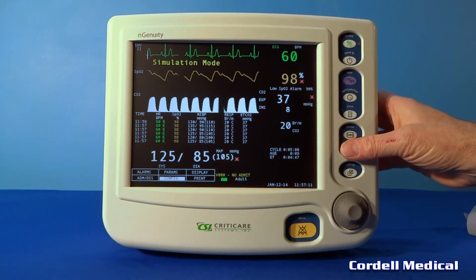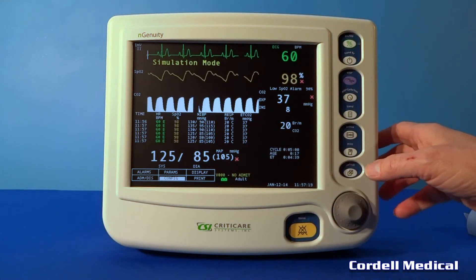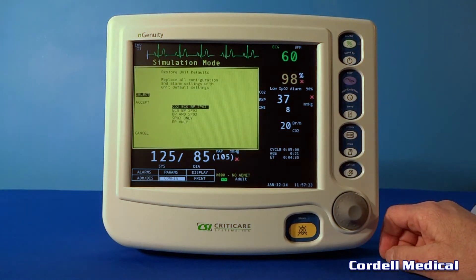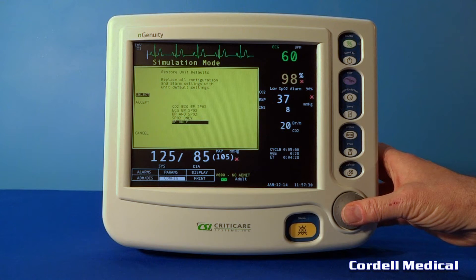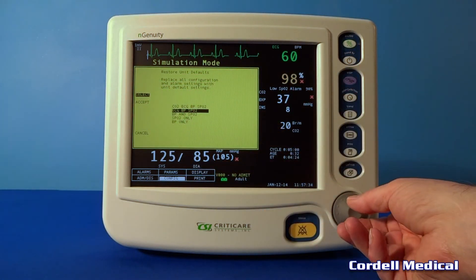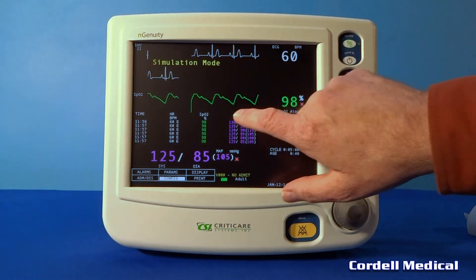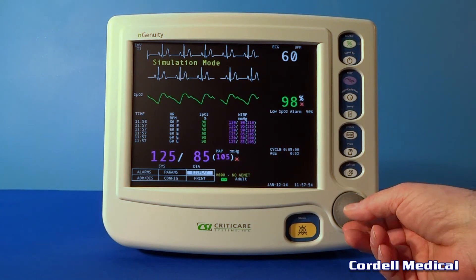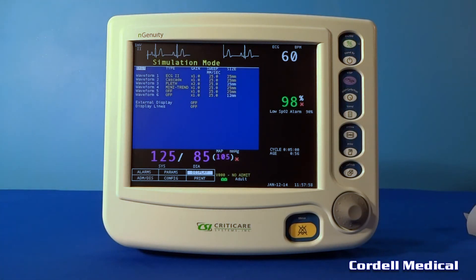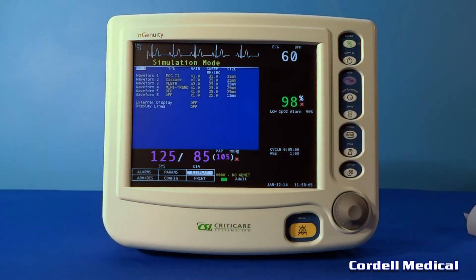When you go to print, pressing the print button once gives you one set of vital signs, and pressing and holding will give you the mini trend. Here you can press and hold and change between functions. Right now we're going to go to ECG, SpO2, NIBP — so at this point we are out of CO2 mode. It's nice to switch back and forth between the two because you do not want to continually take the water trap on and off. Those are the normal settings you'll see when you're not using End-Tidal CO2.